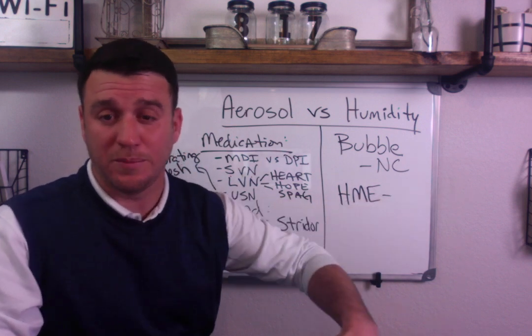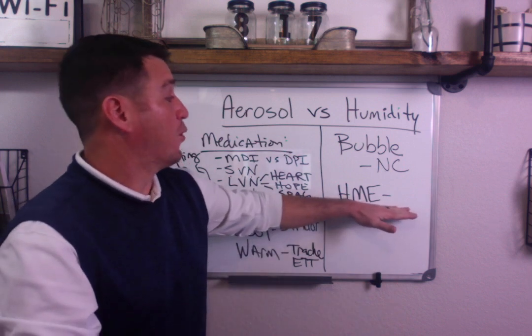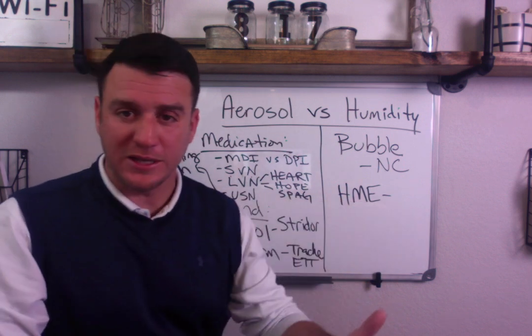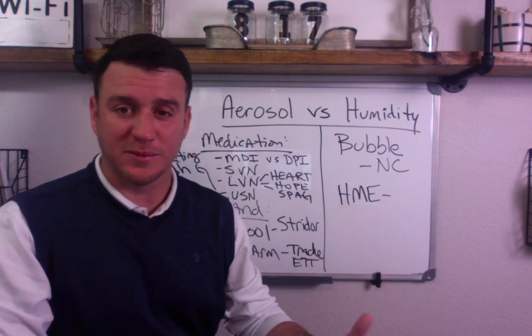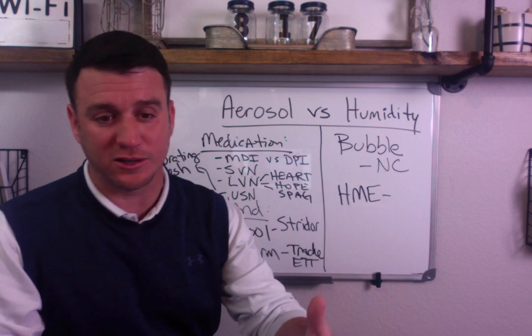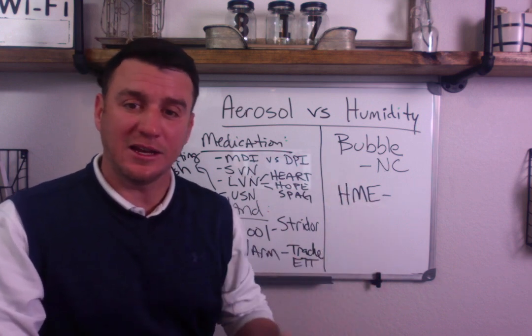You're going to want to switch to a passover humidifier. But for your short-term, your heart patients that come out of bypass, HMEs work wonderful. They save money for the hospital because you're using non-heated circuits instead of heated circuits. And you're providing a good level of heat and humidity for your patient.